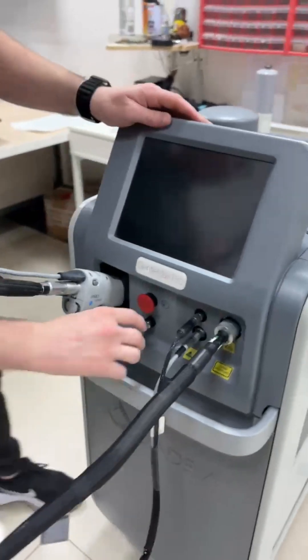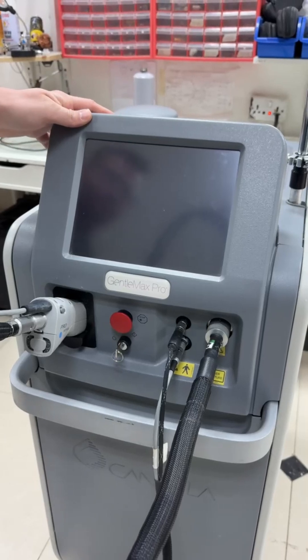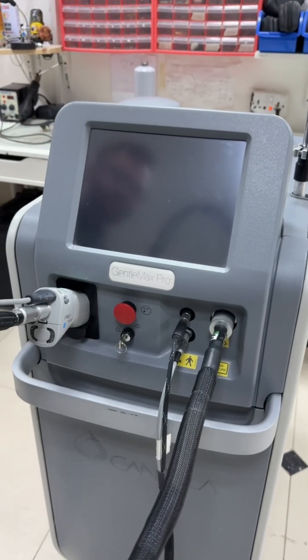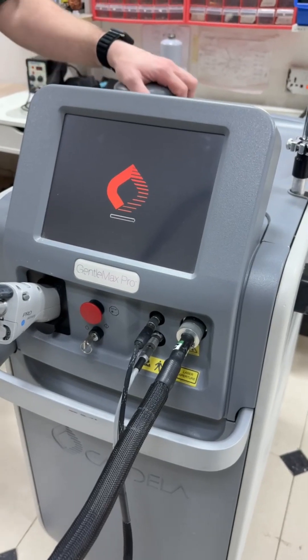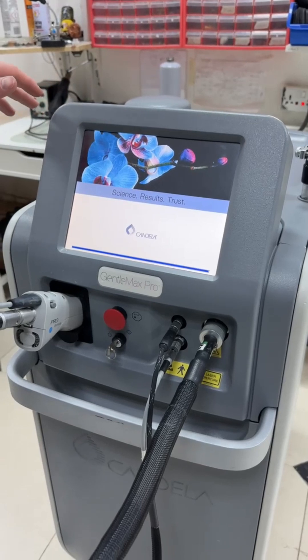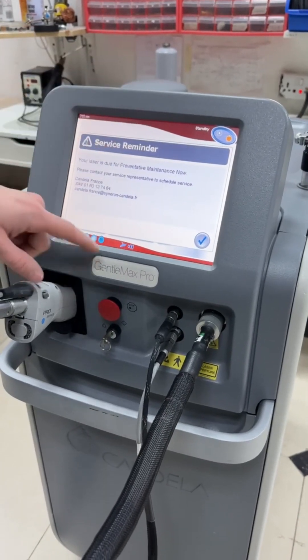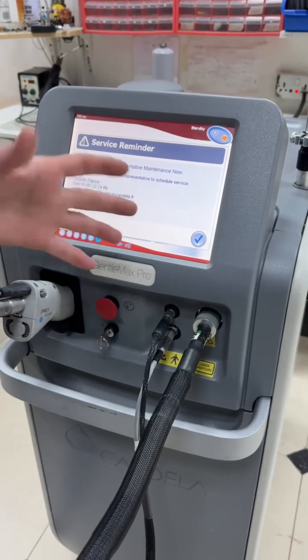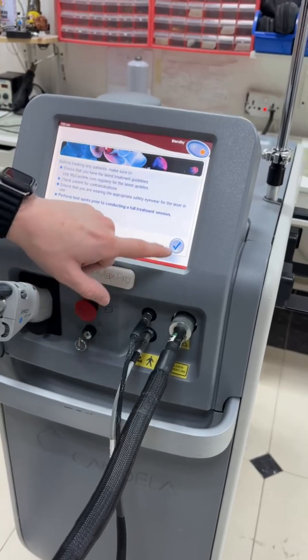Let's switch on the machine and talk about the user interface. The machine usually takes about a couple of minutes to load up. After it finishes booting up, you will see two instruction pages. You can skip these pages by pressing the check icon on the bottom right corner of the screen.